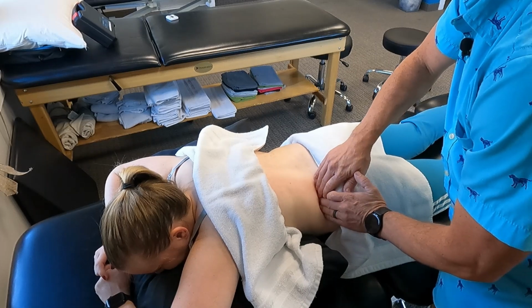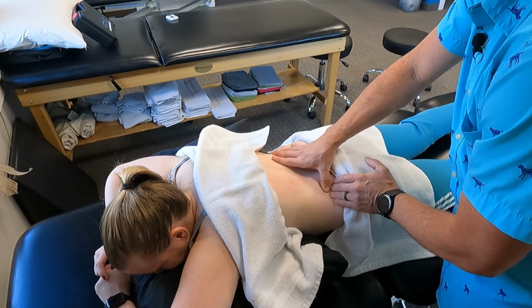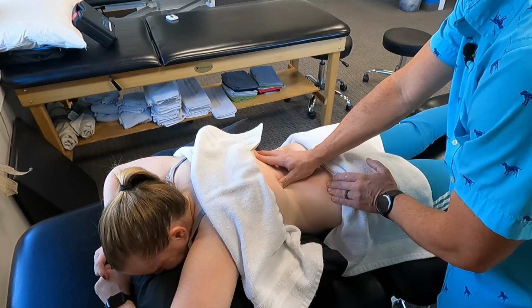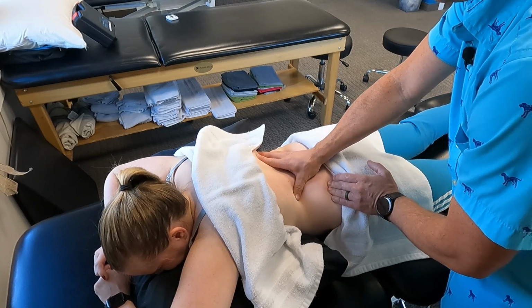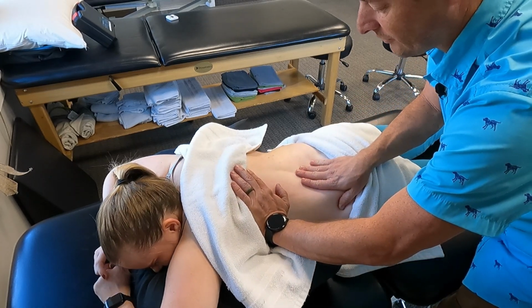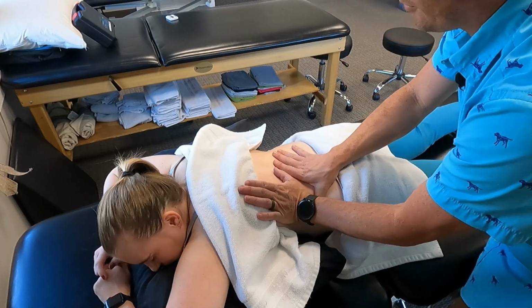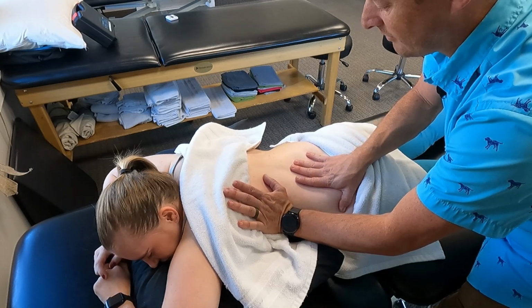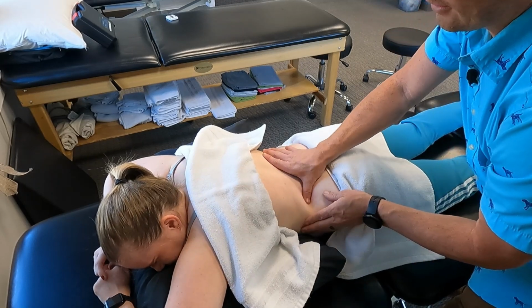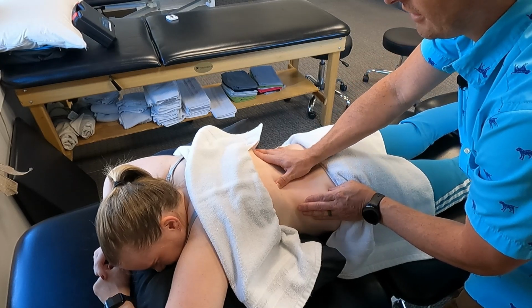Amber doesn't have a ton of space between her pelvis and her ribs, about that much space. And that's part of the problem, is we have that collapse into the concavity that brings the ribs closer to her pelvis. So I'm just trying to get more space. So then I'll do a little bit of stretching here, trying to open that concave side. Does that feel okay, Amber? Yeah. You feel it stretch with that? Yeah. So we're trying to get some mobility and really just stretch out what we just worked on with the tools and with my hands.